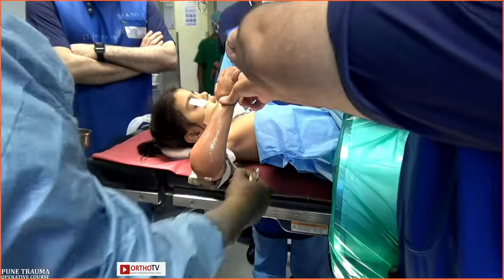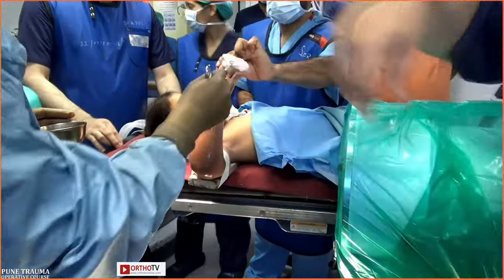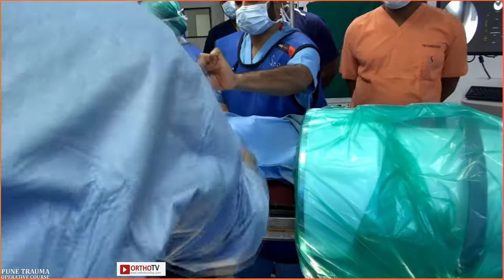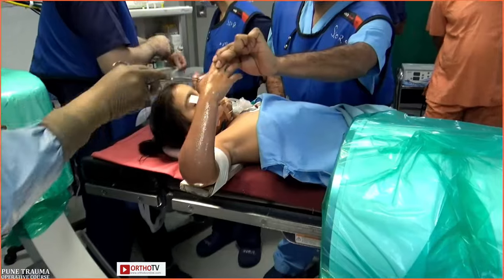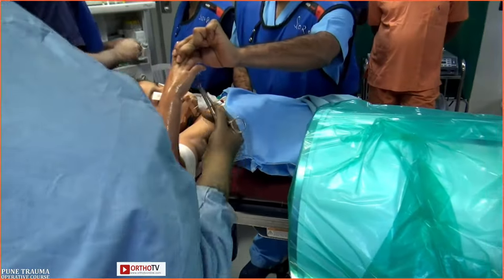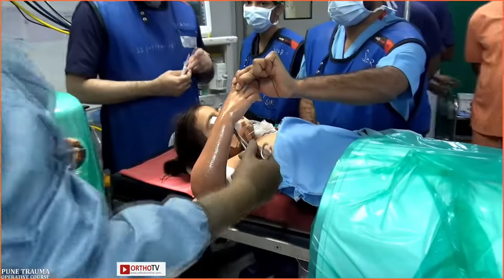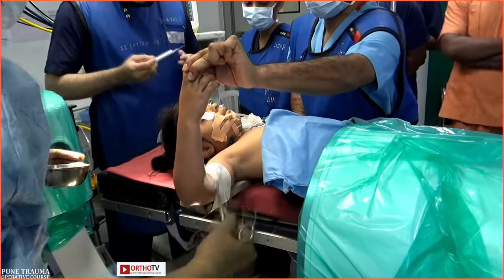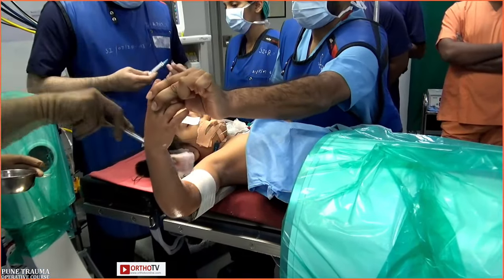Any comments from the panel, Dr. Agashe? Do you put the pin in AP first or lateral? I have a little apprehension about this. The anterior skin crease cannot be prepared properly after flexion. No, sir, we are going to extend it because I've just confirmed the way I'm going to get my reduction. As you can see, I'm extending this.